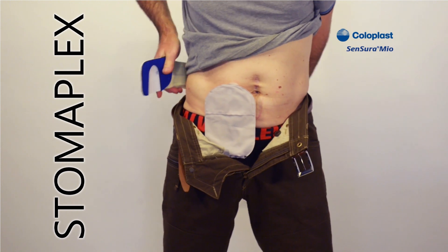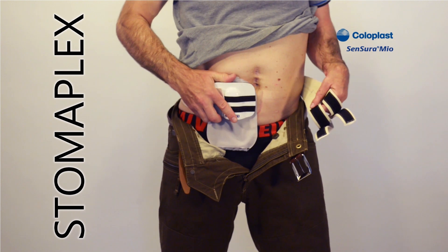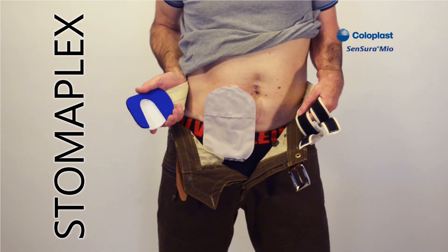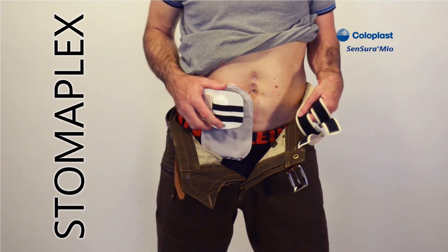If it wasn't for this guard and belt, I would not be able to wear my jeans, which I put on every day. I simply place the guard over the ostomy pouch and make sure it lines up so that the stoma goes into the opening of the guard.